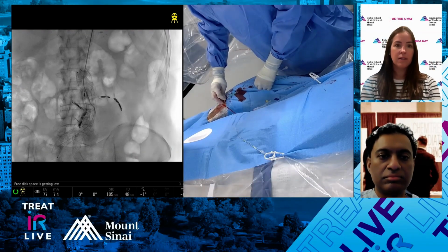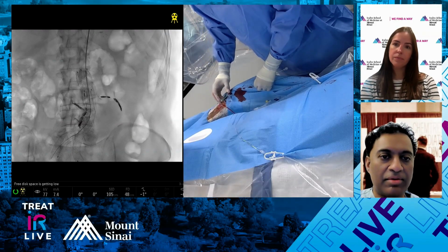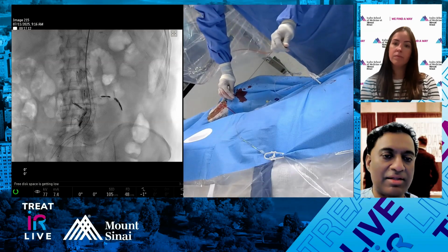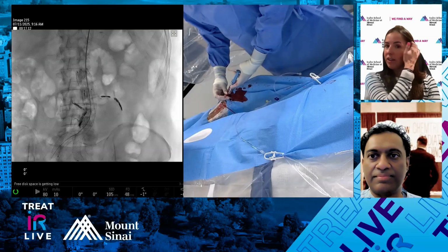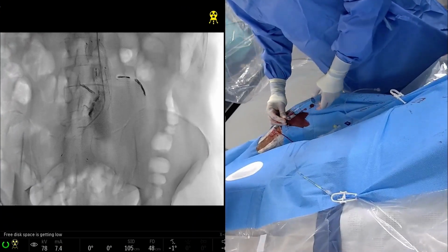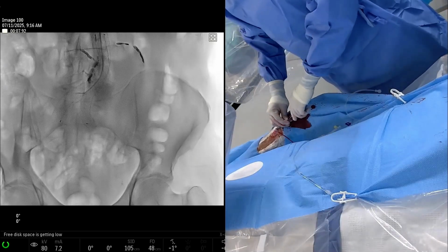It works really nicely. And then, one of the challenges sometimes we'll have in some of these thoracoabdominals is the tortuosity and length of the thoracic. In this case, it doesn't seem too bad. But when you have a lot of elongation, there's a lot of length, unfortunately. I call that being taller on the inside than you are on the outside. But he's okay. So we'll do a run.